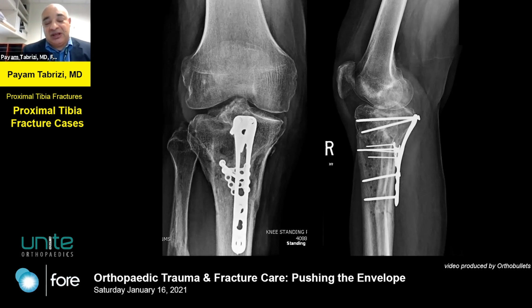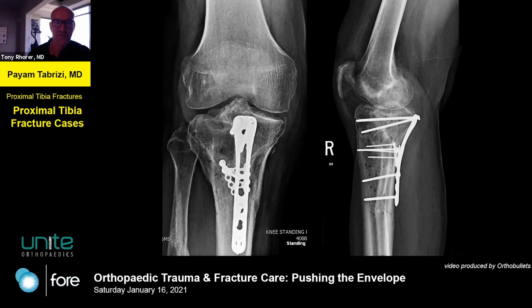So I think the key, for me, what I've learned from this, is if you're going to flip them over and do the lateral part, you've got to make sure the soft tissues are amenable. If not, I think in the future, I'll probably stage this, let the tissues recover, or do something else. For me, I think the plate was too anterior, and obviously the soft tissues weren't ready for dual incisions at this point. Yeah, so the plate ends up becoming like a soft tissue expander, right? If you end up with a little bit of redundant tissue, so that's cool.